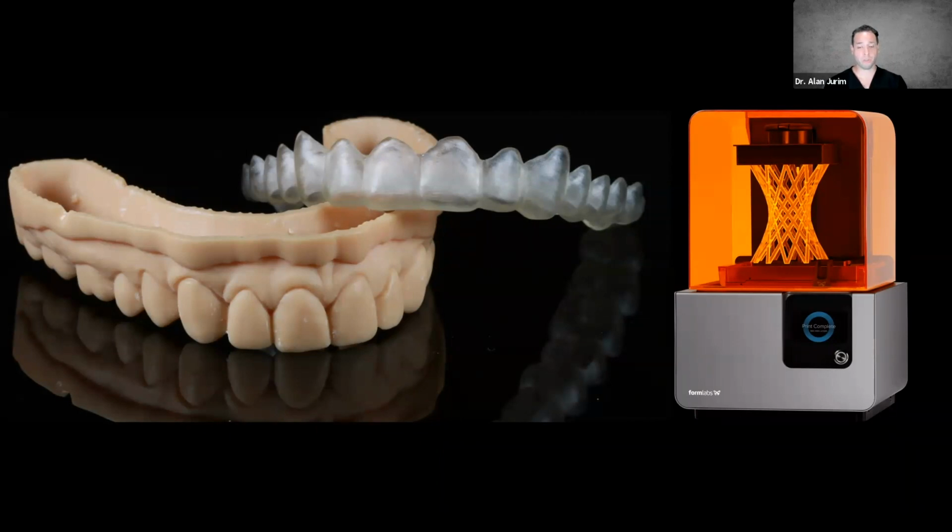When we were producing bite splints by hand, that would be 4 hours of work for me to go back and recreate this and adjust it. Now we have the ability to save the file, send the file back to the printer, and immediately reproduce it. Another really great benefit that I've learned about producing 3D bite splints or night guards, after, let's say, a patient has completed ortho, or like you see here, a veneer case, is the final scan that we take to produce the bite splint. The final scan, everything is in place, everything is great, the patient loves it. That final scan is some of the most valuable data.